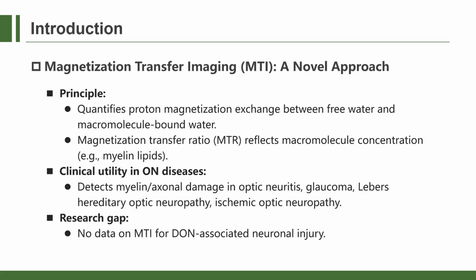MTI, an advanced quantitative MRI technique, can provide information on the proton magnetization exchange between free water and the macromolecular bound water. The derived MTR reflects the concentrations of macromolecules in physiological environments, such as lipid-rich myelin sheath of the ON. MTI has been used to assess myelin sheath damage and axonal loss in several ON diseases. However, to the best of our knowledge, data on the application of MTI to detect neuronal injury in the ON of patients with DON are still lacking.